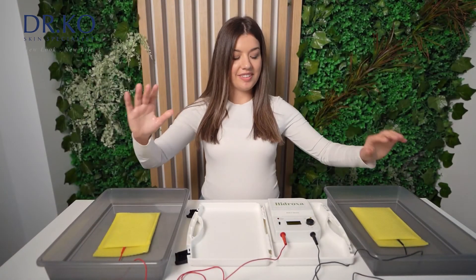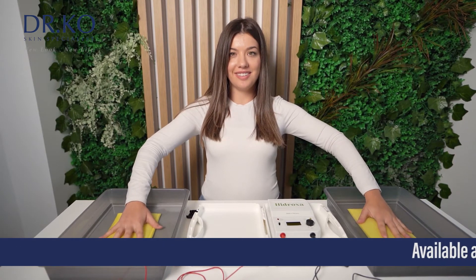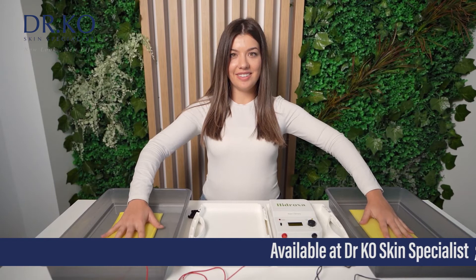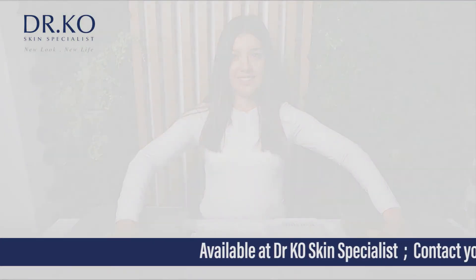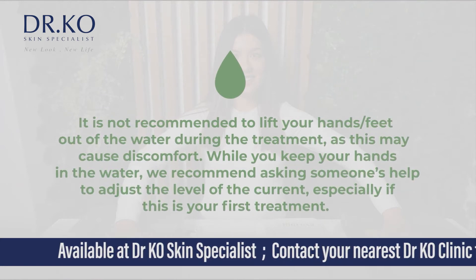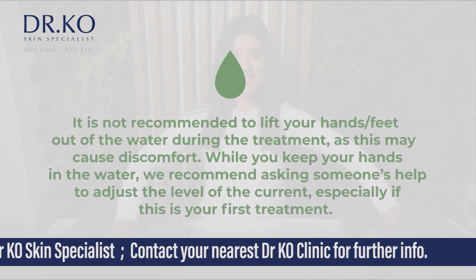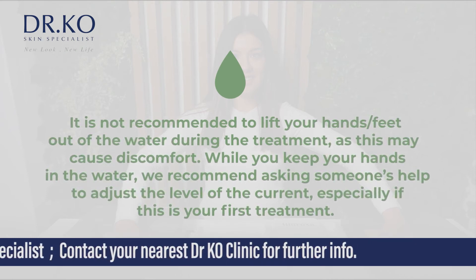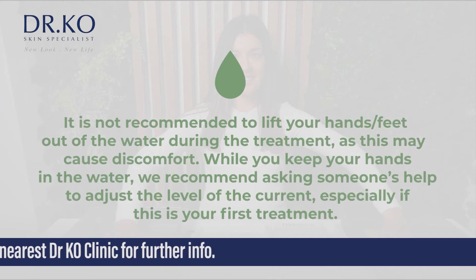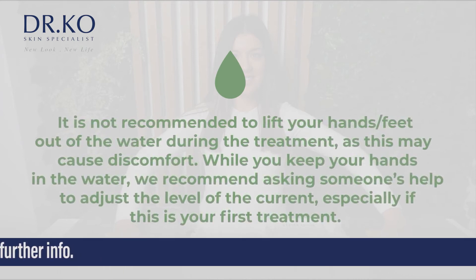Now you are ready to start with your treatment. Place each hand on top of the electrodes, one in each container. This will start the treatment session. It is not recommended to lift your hands or feet out of the water during the treatment, as this may cause discomfort. While you keep your hands in the water, we recommend asking someone's help to adjust the level of the current, especially if this is your first treatment.